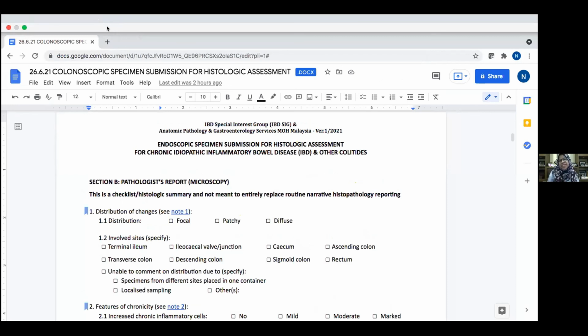If I see just rare microgranulomas and I feel it is a case of Crohn's disease, with other changes of chronicity as well, I don't do ZN or PAS. If I see intermediate size granulomas where I'm not so certain whether this could be Crohn's disease or TB, then yes, I do.